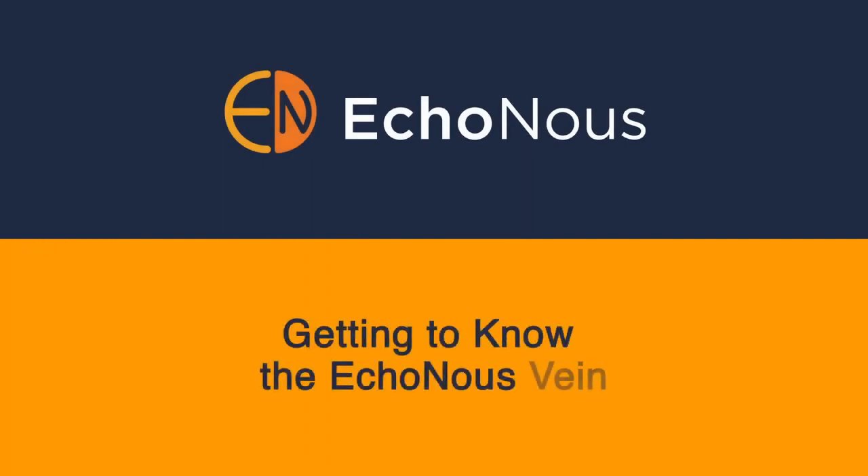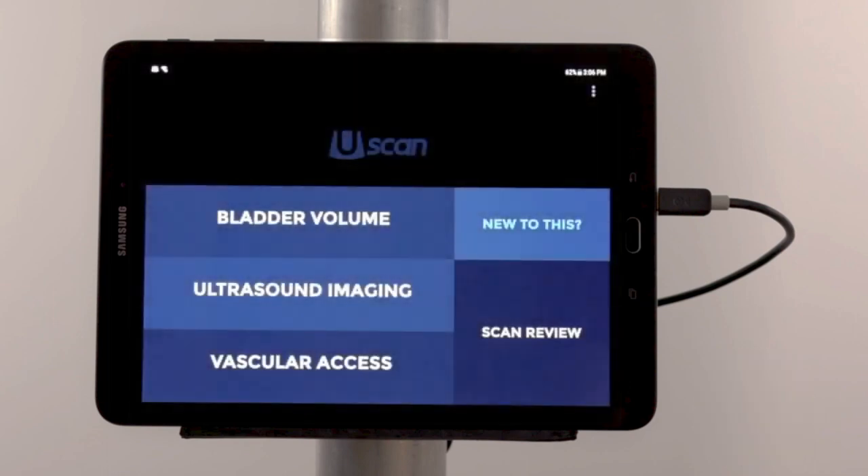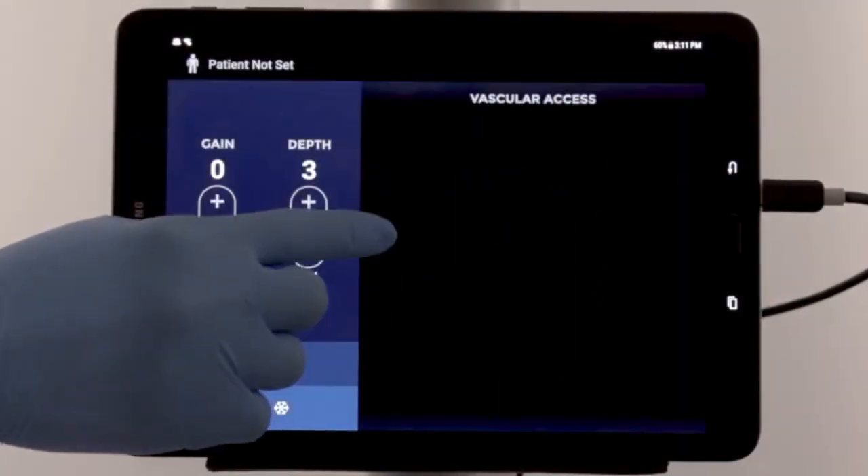Getting to know the Echinose vein. The display will power on in about 30 seconds. When you see the menu, select Vascular Access, then choose Adult or Pediatric.